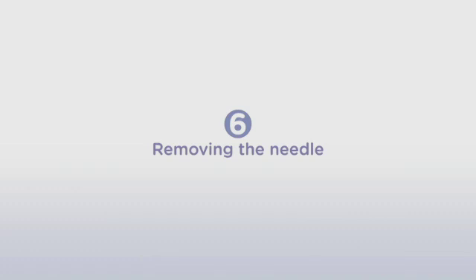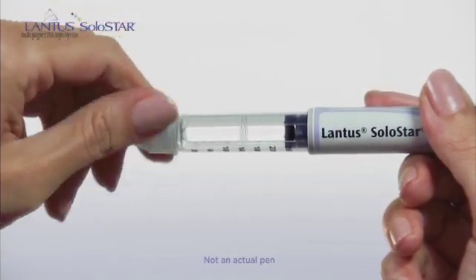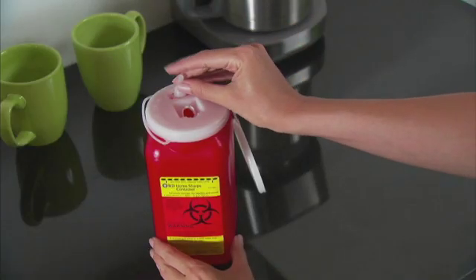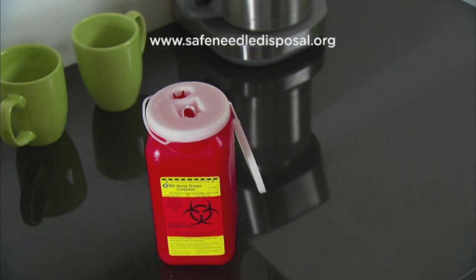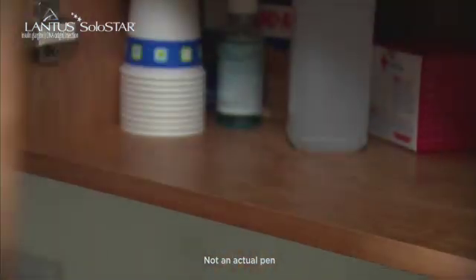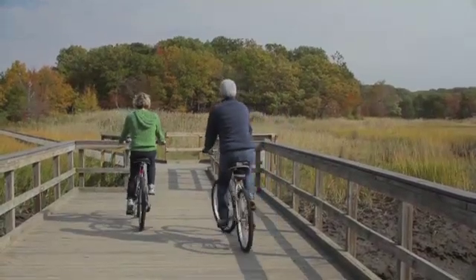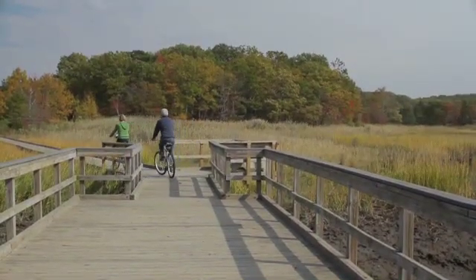Now let's go to the last step, Step 6, Removing the Needle. Put the outer needle cap back on the needle and use it to unscrew the needle from the pen. If you have a push-on needle, then pull the outer needle cap from the pen. Discard the needle and the needle cap the way your healthcare provider told you to do it. You can use a sharps container or visit www.SafeNeedleDisposal.org for other safe ways to dispose of used needles. Put the pen cap back on the pen and store it in a safe place. With practice, you can do this, but if you forget a step or two, just play the video again. You can also read these injection instructions in the full prescribing information at the link above.